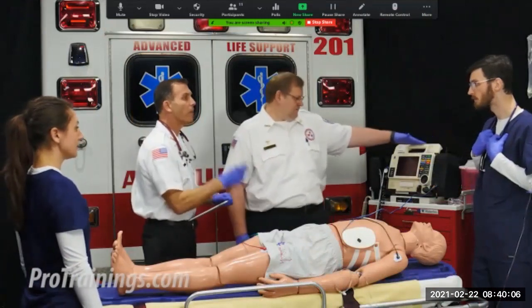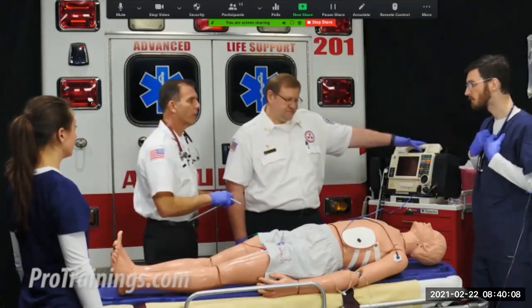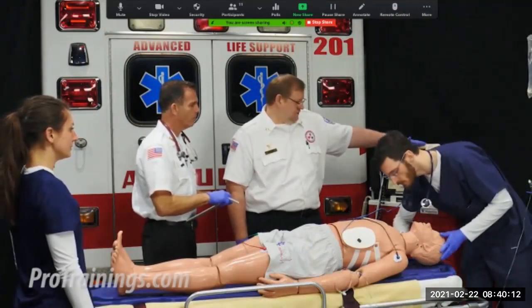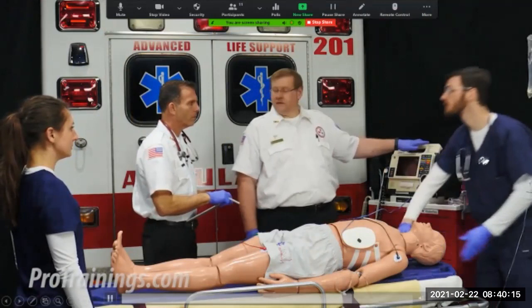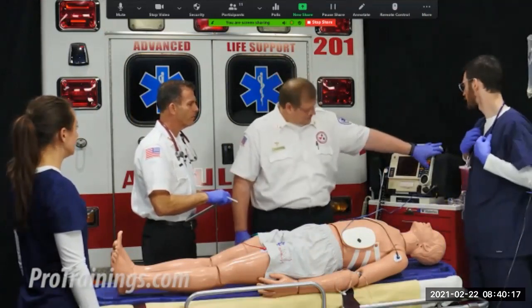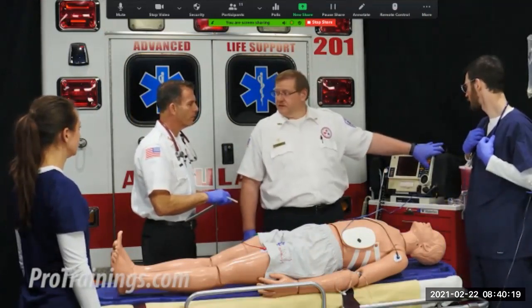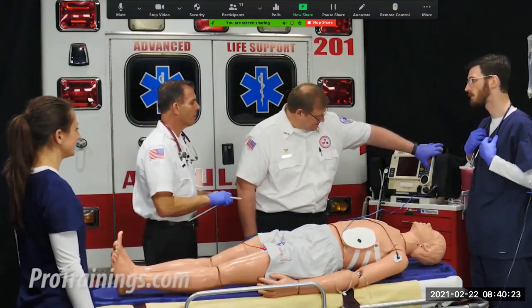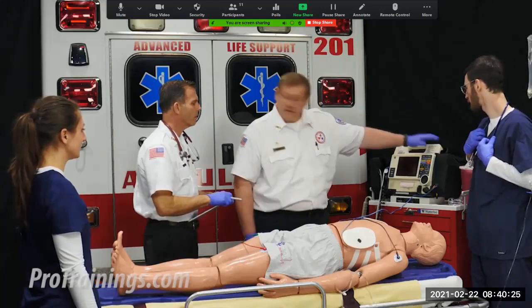In our scenario, we turned the rate up to 68, and then we began to see that the patient became responsive again. Upon checking the vitals, we now have respiratory rate of 16, a heart rate of 68 under capture with a transcutaneous pacemaker, and the blood pressure of 96 over 60 with a pulse ox up to 96%.